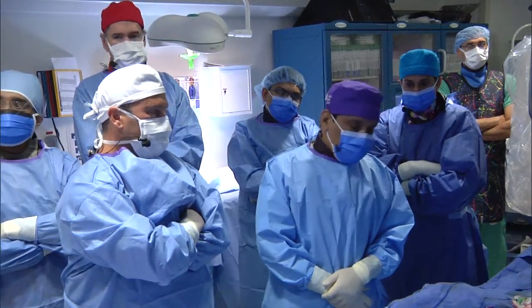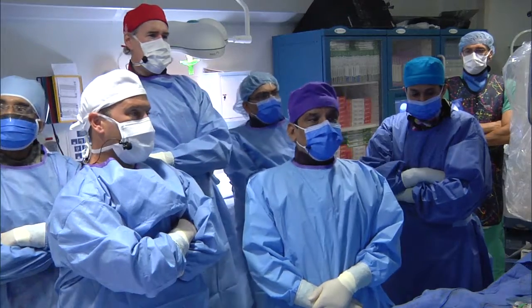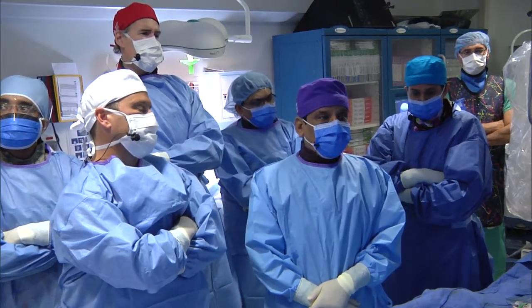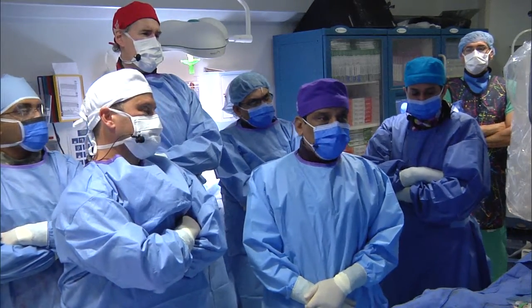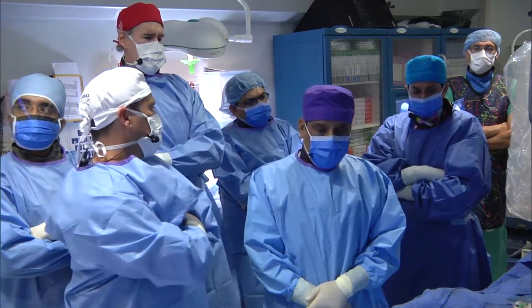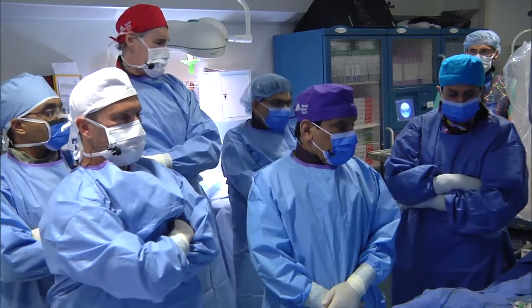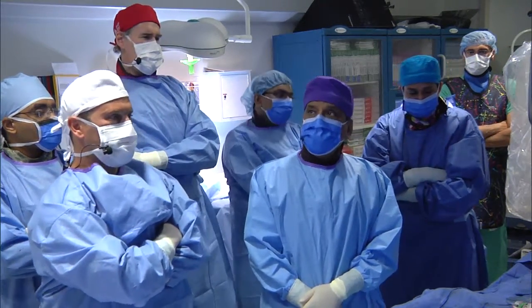Now I'll ask a question to Dr. Keeney. Very tight valve. So the question is, should we do a balloon aortic valvuloplasty in all these very tight valves before placing the TAVR, or should we just go ahead with a minimal touch technique and try to put the valve in? What do you think? Because the valve is very tight, although we have done valvuloplasty about 5 months ago.